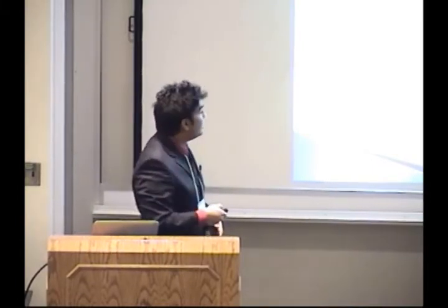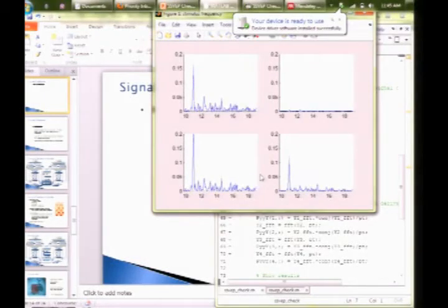And so once we get a signal with the highest signal-to-noise ratio, we can take an FFT of it, and then we'll see in our FFT that you will have strong peaks at the same hertz that you were actually staring at. So I have a quick MATLAB demo of actual data we took in the lab, so I'll show you guys that really quick. So you see in this figure, this is live, and what's going on is you're staring at an 11 hertz signal, and over time, this peak just shoots all the way up.